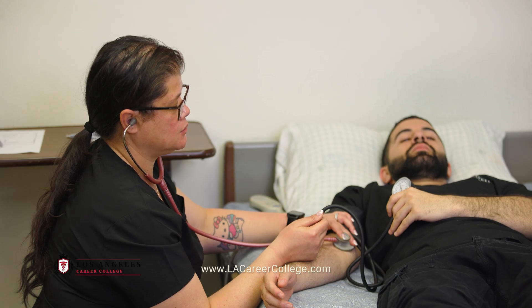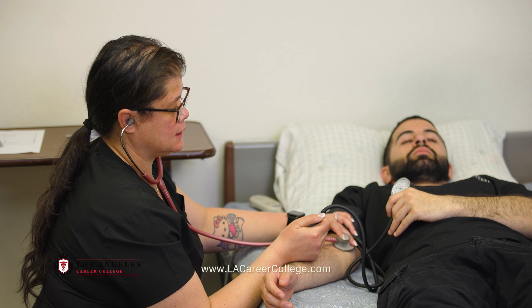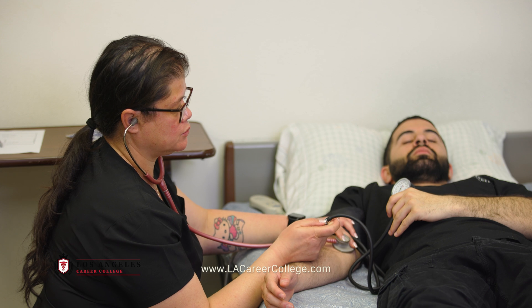Once you hear your diastolic reading, release the valve completely in the counter-clockwise direction to release the cuff.